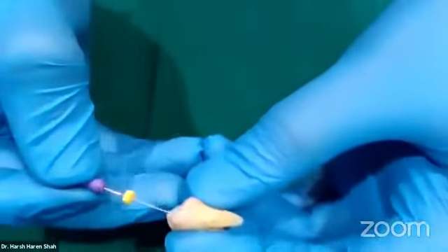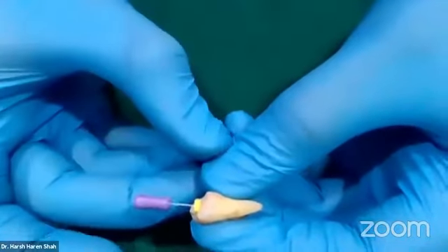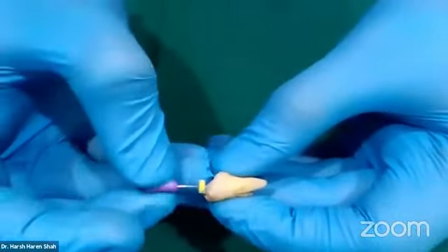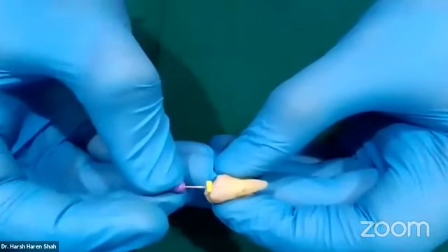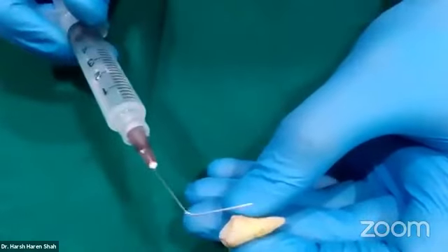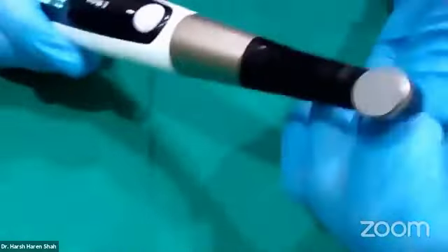In the palatal canal here, the file goes, yes, but with a little bit of effort. This effort is what you should not be requiring. So I will take this 10 number K file out. I will irrigate with sodium hypochlorite here. I will just carry the 10 number K file till the full working length if it is possible. I'll remove it out one more time. I will irrigate with sodium hypochlorite again. And then what we will do is we will use the endomotor and the 1G file.